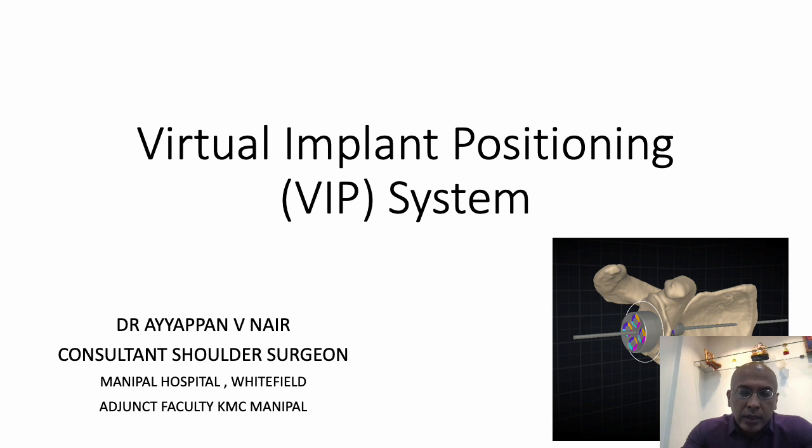So here, this is a presentation. I had given a lecture at Pune Shoulder Course in January 2025, where I presented about the virtual implant positioning system, called the VIP system, by a company called Arthrex. This software basically helps us plan surgery, especially shoulder replacement surgery.